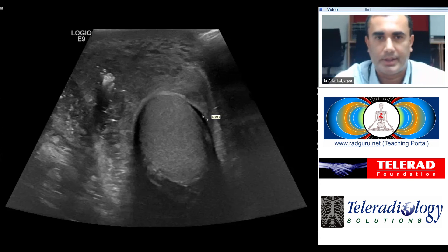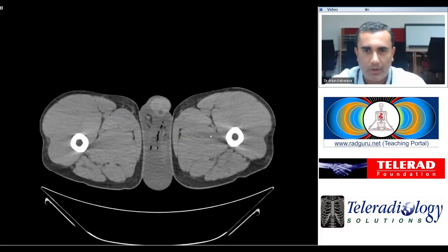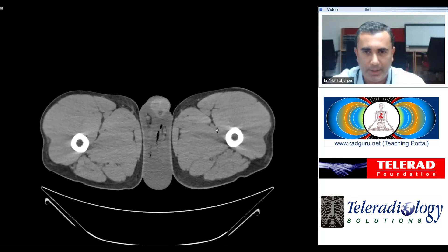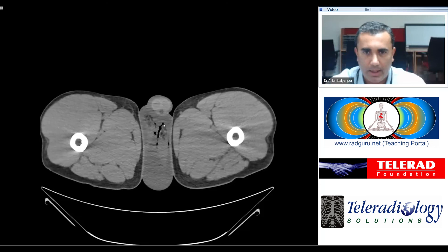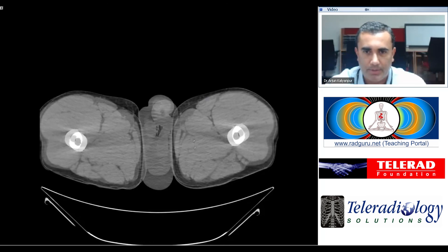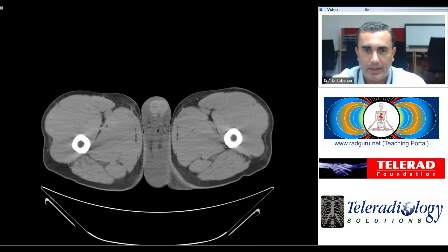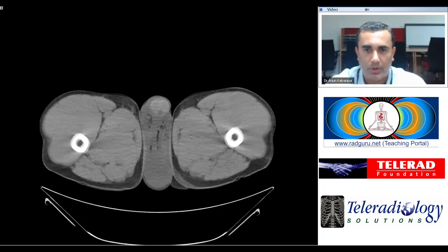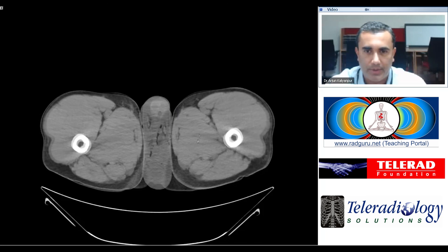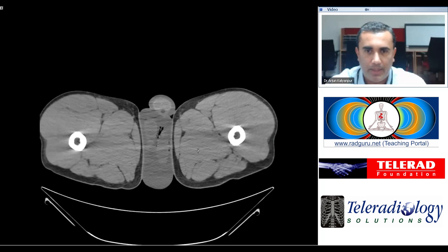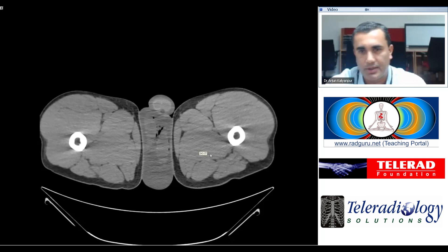The corresponding CT of the same patient shows significant scrotal wall edema, and we can see the characteristic appearance of air within the scrotum in the form of extremely low attenuation foci, which correspond with the echogenic dots seen on the prior ultrasound. The concern here is for Fournier's gangrene of the scrotum, and this is an extreme surgical emergency which needs to be immediately communicated by radiologists to the treating physician and surgeons.